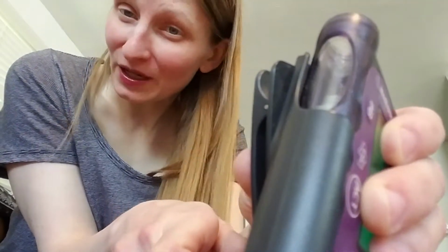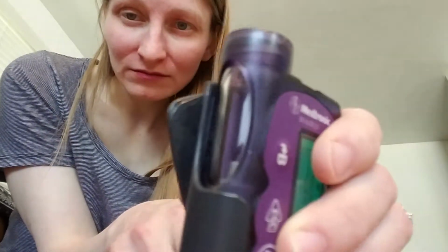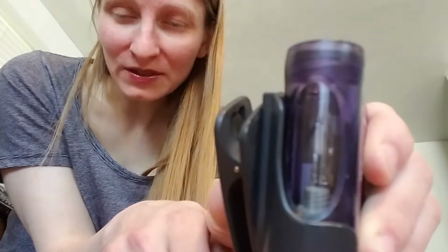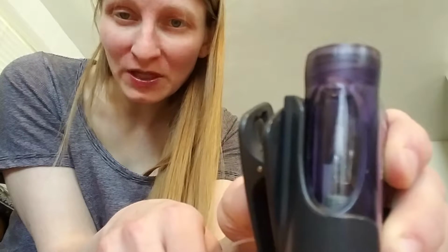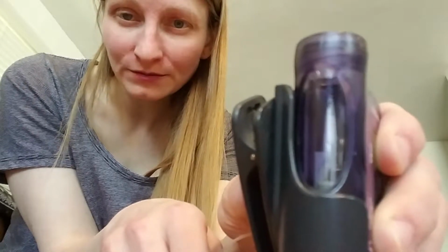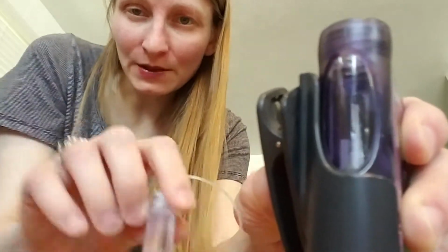Might not seem like much, but like I said, having to do this in the middle of the night when you're really tired, it's not so much fun. Seems like there's always alarms going on. Okay, it's almost done. You'll hear it beep when it's done. Okay, that means it's ready for me to put this in, but then I have to twist it because it's got a threaded top.